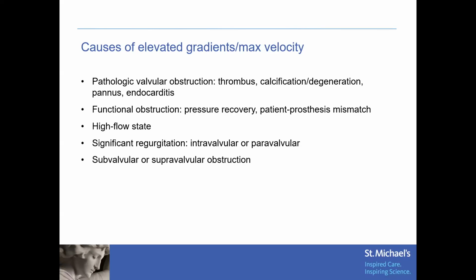And then also, when we are assessing these valves, particularly prosthetic valves, where there's a lot of shadowing involved, you may miss the subvalvular and supravalvular membranes and structures. So just always keep in mind that, if the valve looks a certain way, is opening really well, but the gradients you're getting are really high, there seems to be some discrepancy. Maybe we're missing a subvalvular or supravalvular structure that is falsely elevating the gradient, and the gradient that we're measuring is not actually from the valve itself.